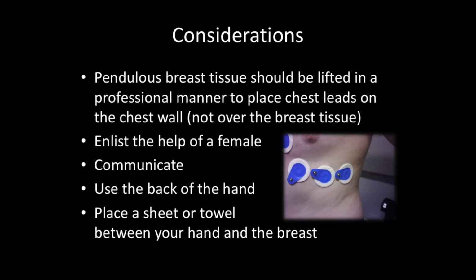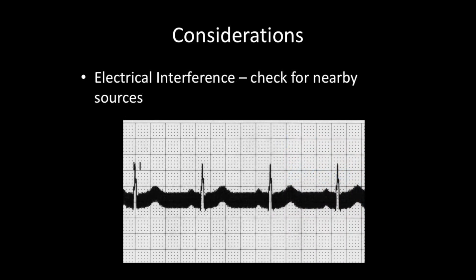Okay. What is this? Artifact, yeah. Or electrical interference, if I read the slide. What kind of electrical interference? 50 to 60 hertz. So when you have this funny looking EKG line that should be thin, like these other lines, it's 50 to 60 hertz interference. It's an electrical source, like an electrical cable or whatever running around. I don't know, maybe they have their night light lamp across their belly or something like that. Unlikely, but that's what this is. So how do you change it? By removing the source of that 50 to 60 hertz interference.